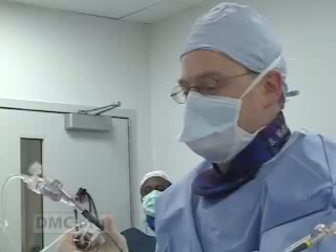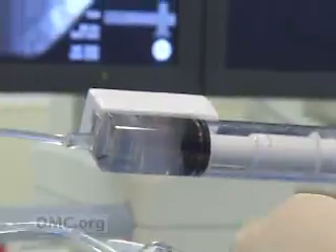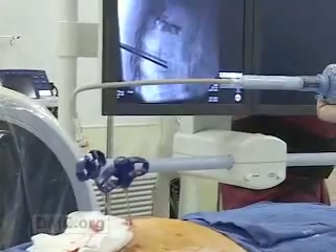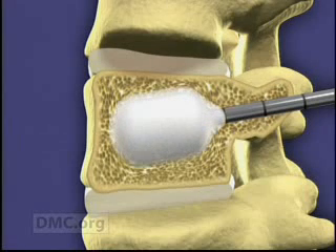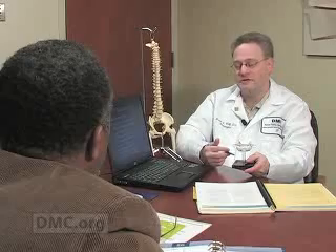The balloon is inflated to raise the collapsed vertebra and return it to its normal position. Then the balloon is deflated and removed, and the cavity is filled with a special cement to support the surrounding bone and prevent collapse. The cement forms an internal cast that holds the vertebra in place. As soon as the patients wake up from their sedation, the overwhelming majority get almost immediate relief, or usually within 24 to 36 hours — their pain is significantly different.